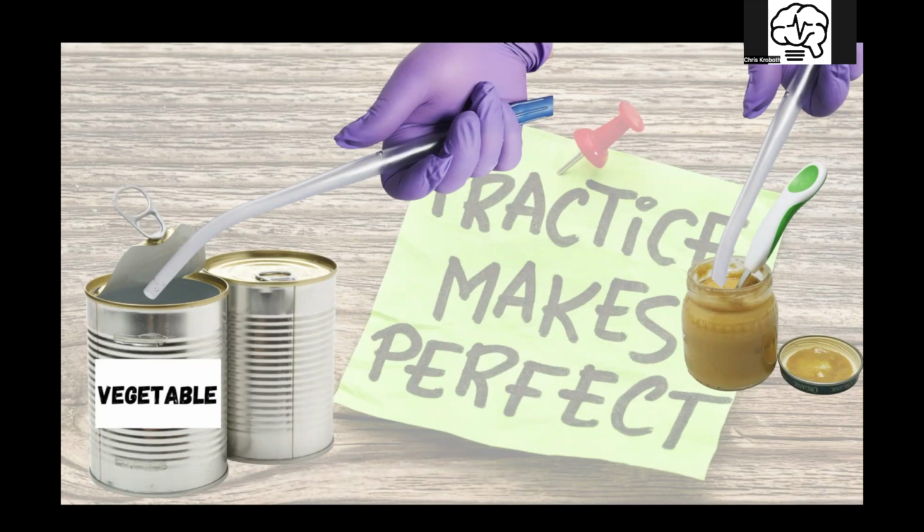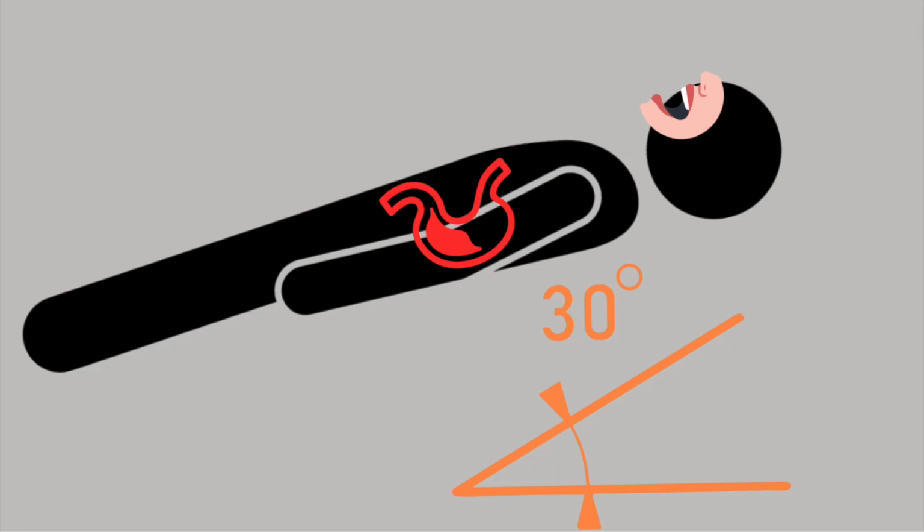Let somebody else practice. And then if you want to get good, put a Dixie cup in the mouth of a mannequin. And then you can pour the Dixie cup full and have them practice so you can actually practice positioning. Ideally, in the real world, you would want to suction with the head up a little bit so that the stomach contents stay down, right?